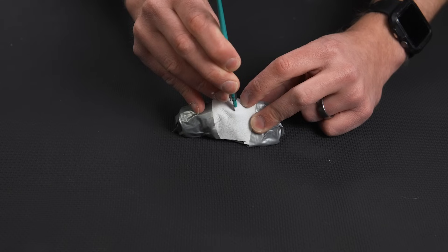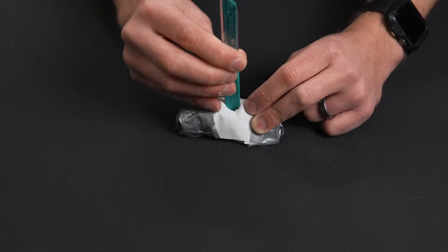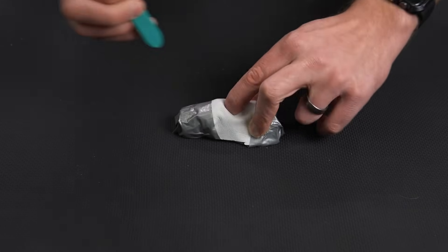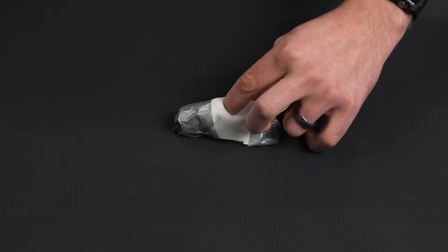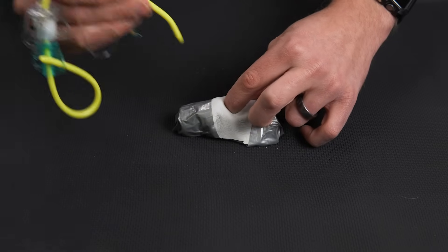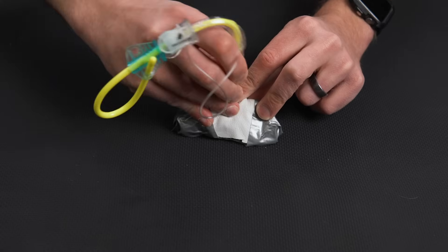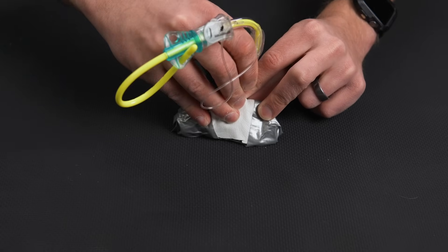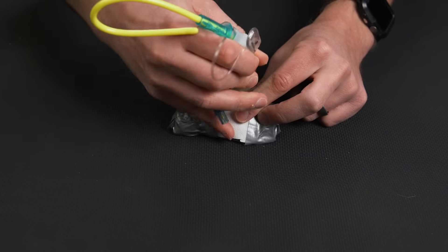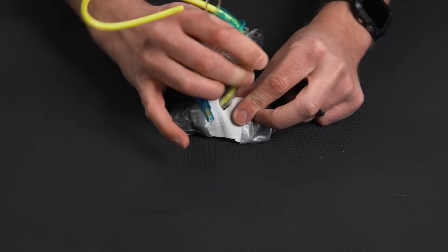We're then going to take the scalpel out and you can either blunt dissect with your finger or take the opposite end of the scalpel and make the hole slightly bigger. Insert your finger to the side. Once again, we're palpating those tracheal rings. I'm then going to take my tube with the bougie introducer. I'm going to slide that in beside my finger. Hopefully feel those tracheal rings with the coude tip. And we're going to insert until we can't go any farther because it hit the carina and then insert the tube after it.